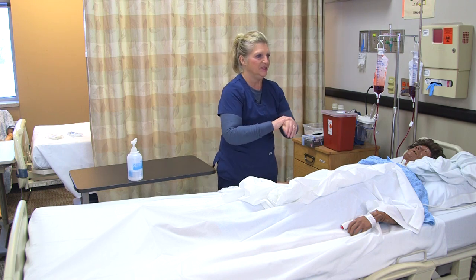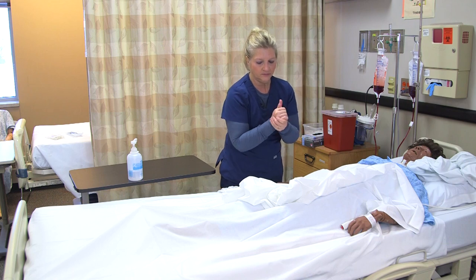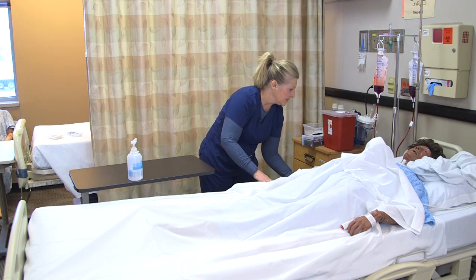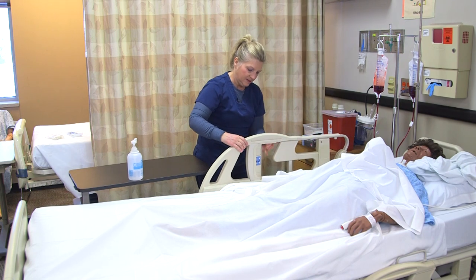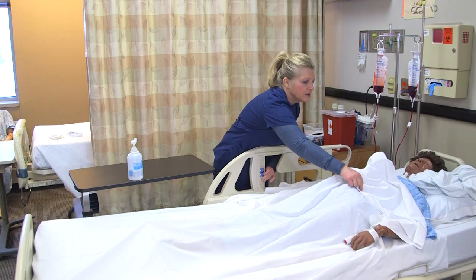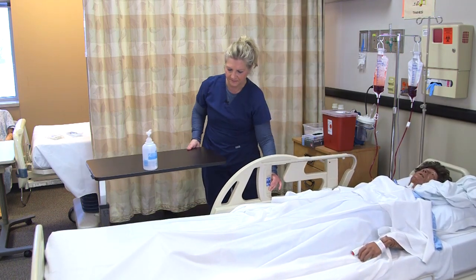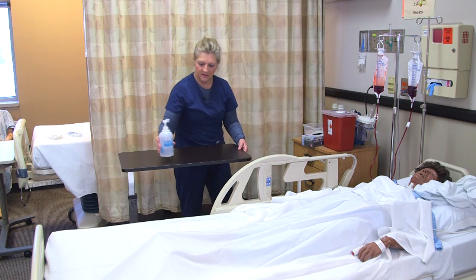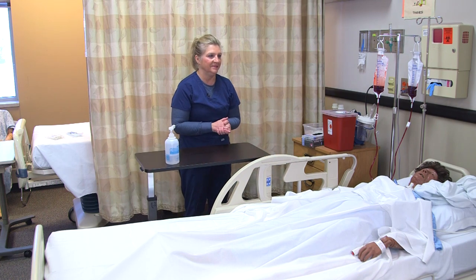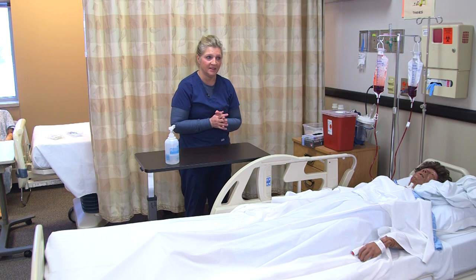Wash hands again and put the patient in a comfortable position. Put the side rails up, bed locked and lowered, call light within reach, and tray table next to the patient. Then document everything you did and how the patient tolerated the procedure.